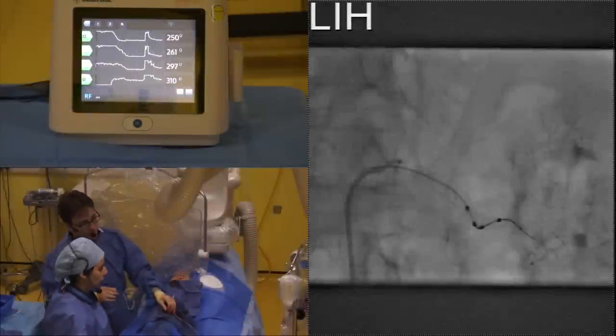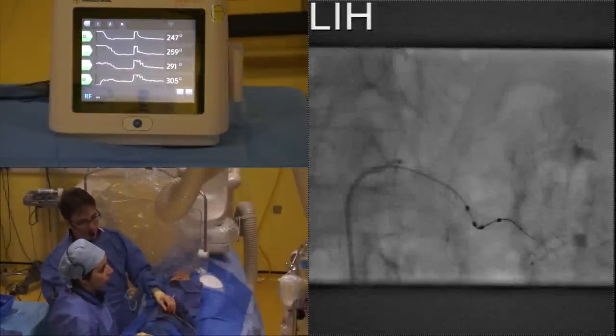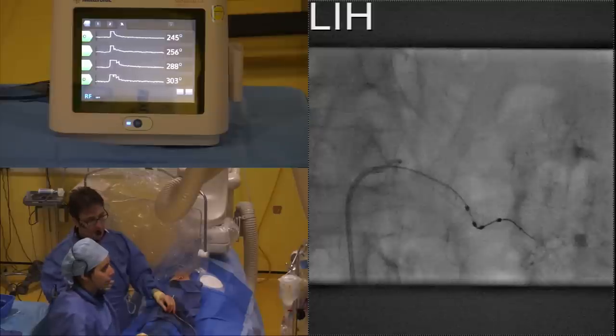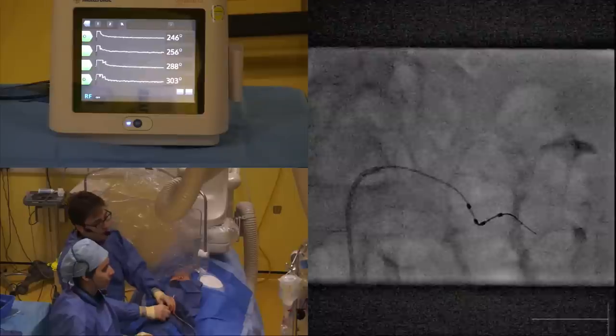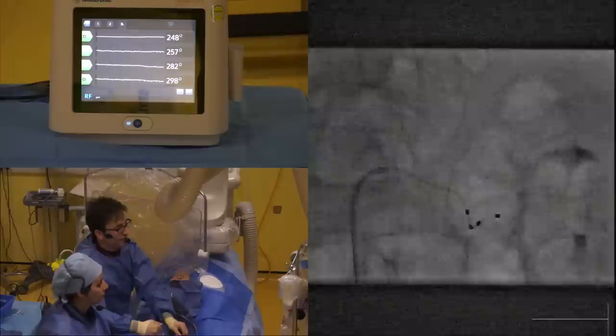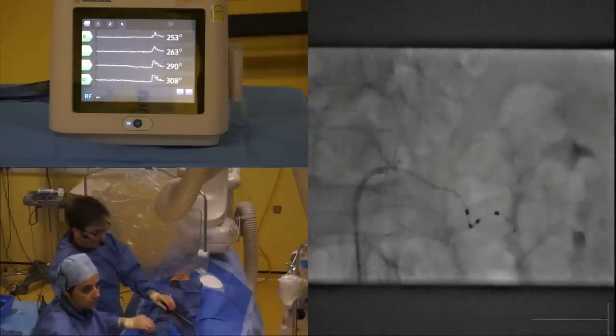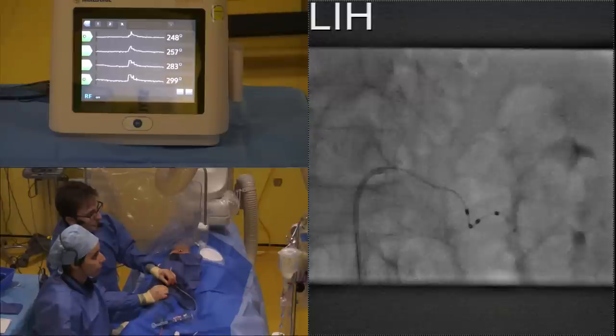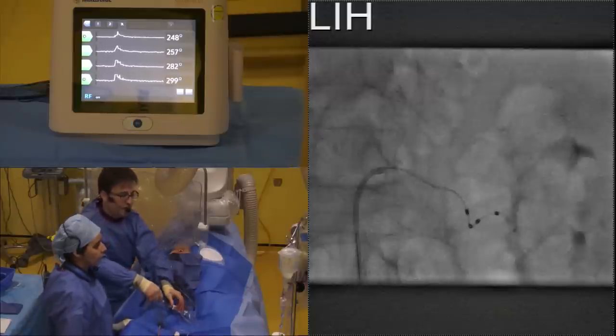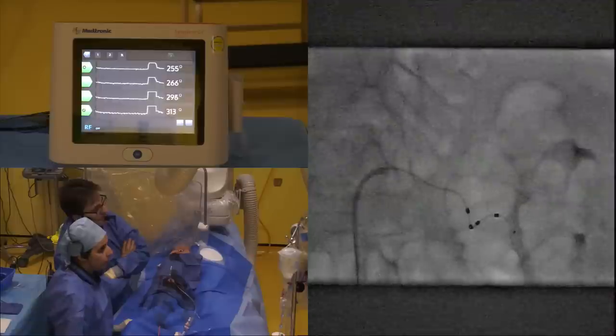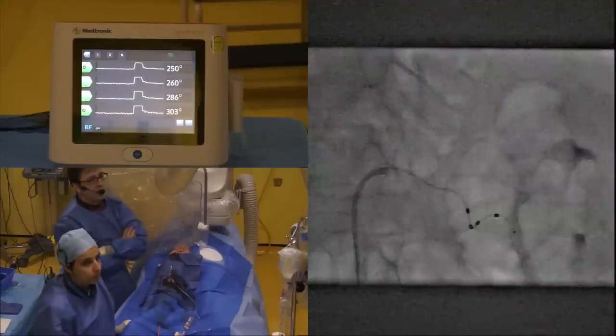I think that's probably about right. I think that's pretty perfect. The training that I've been given here is essentially the distal most marker on the catheter. That's where you should position that, just by the bifurcation. And then, as you pull the wire out, the actual catheter springs back and it takes up the intrinsic shape of the vessel. I'm going to just take the wire back now. And you saw just a little bit of movement there. And just another quick check. Can you just put the impedance generator chart on the screen, thanks a lot? Colin, you can see those nice and clear there?